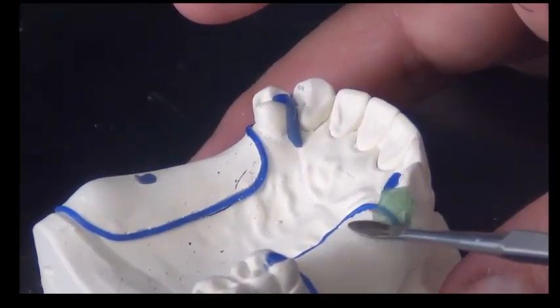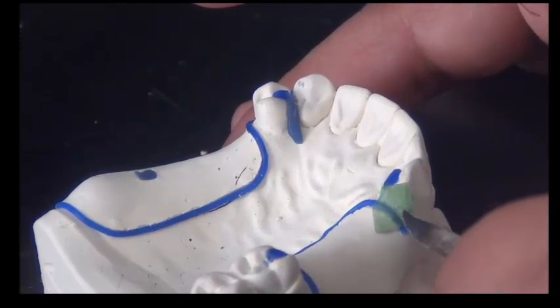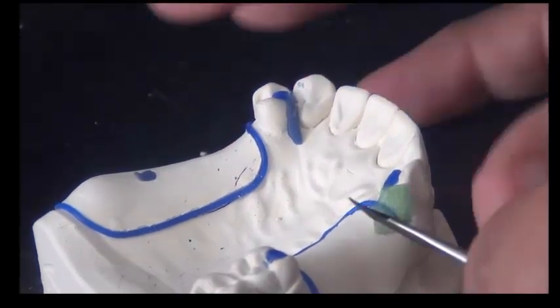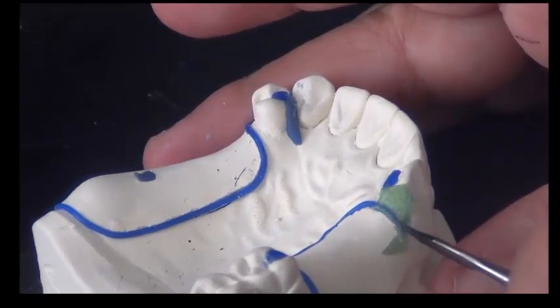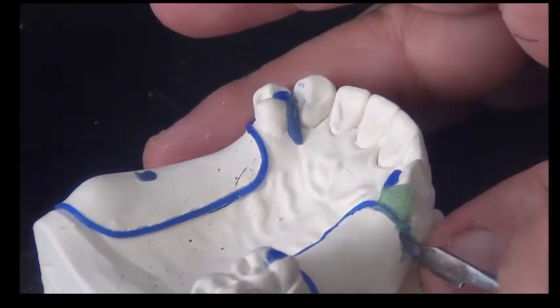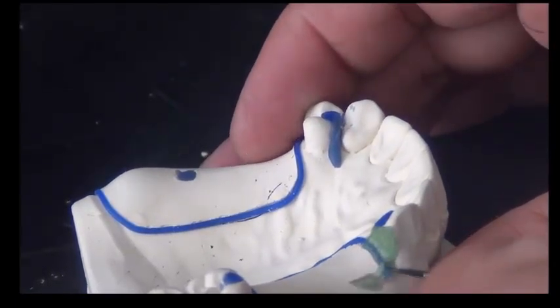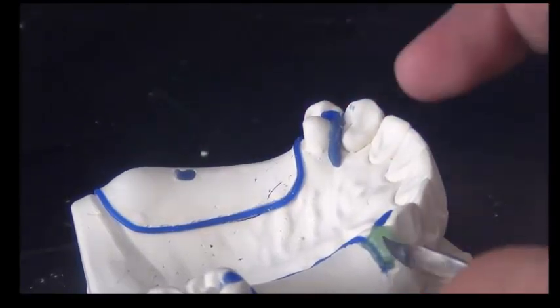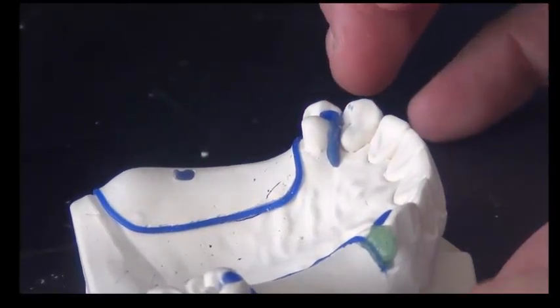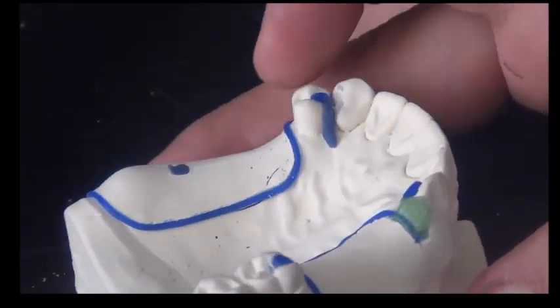But this pressure is minor because I want to ensure that the thickness of this plate has not changed. So this is the guide plate added. Any excess on the ridge area, I just remove it to make sure that here we have a smooth junction between the guide plate and the next metal we will add. So this is the one added to the canine.